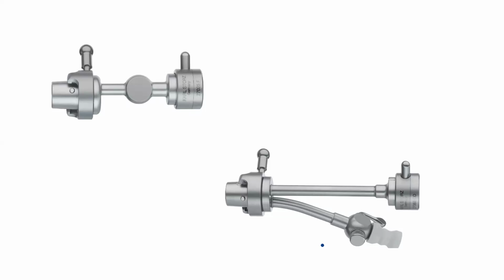VIU sheath. Usually the VIU sheath is used with a working element. But if you would like to use the VIU sheath, and after going in you want to change it and do a formal cystoscopy, you have to have this long bridge. You cannot attach the cystoscopy bridge, it will never fit there. The telescope will come out. So you must be aware that there is a long bridge which fits on the VIU sheath. Yes, sir.